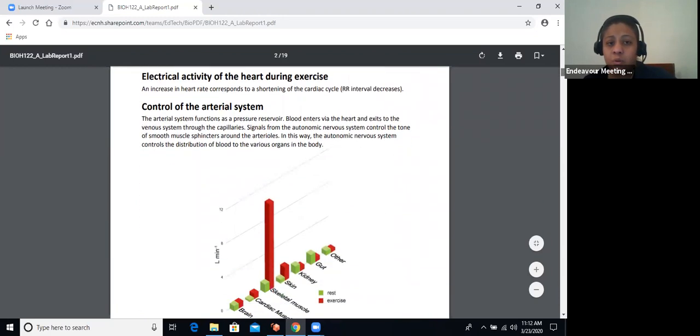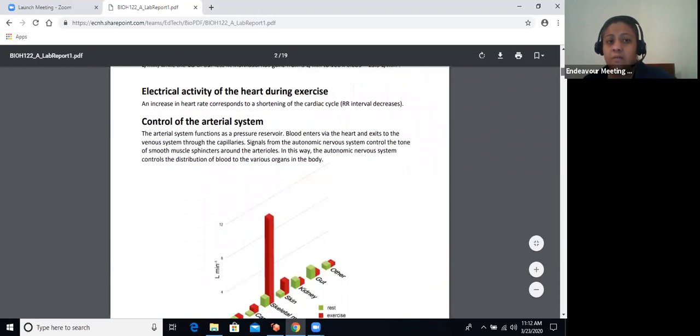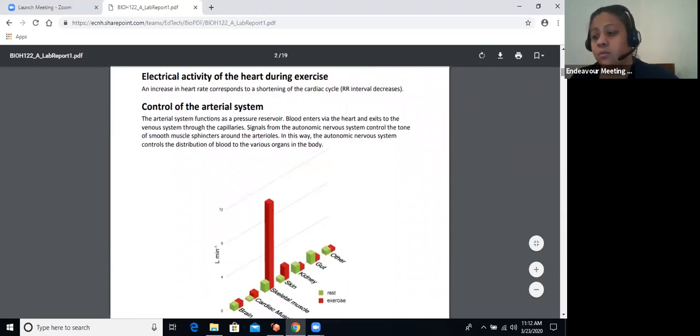What I was saying earlier before we were logged out of the webinar is that to look at the cardiac activity, we use ECG. Traditionally we use a 12-lead ECG where 6 of these are the chest leads. They put them on the chest and look at the different aspects of the heart from different angles. So you can look at all the parts of the heart, including the interventricular septum, the chambers, the anterior surface, the inferior surface, and the sides and everything.